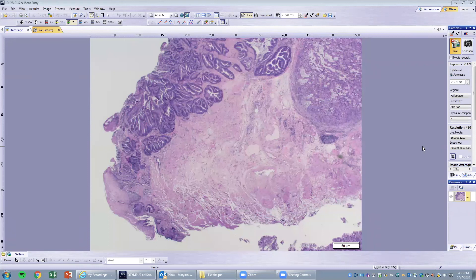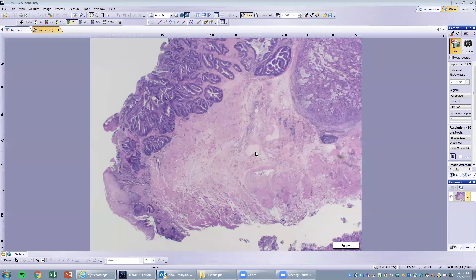This is the last case — an endoscopic mucosal resection, or EMR, where a nodule was found in a patient with a history of Barrett's and they were trying to endoscopically remove the nodule. You have squamous epithelium, muscularis mucosa, and very limited submucosa with large lymphatics and blood vessels.